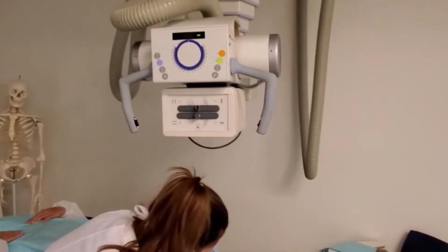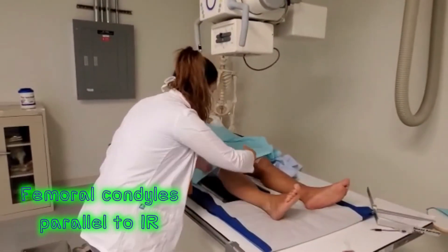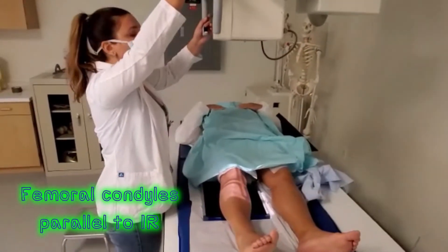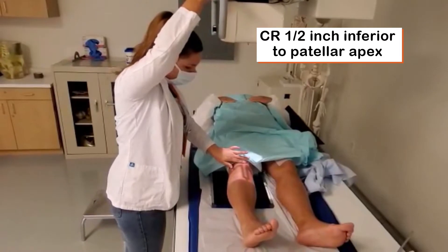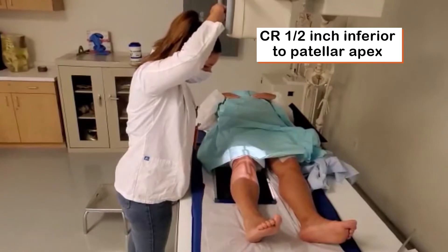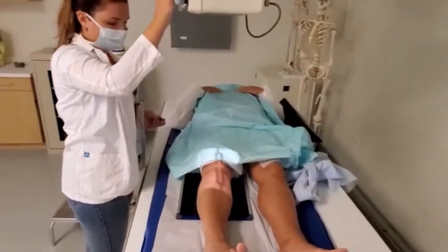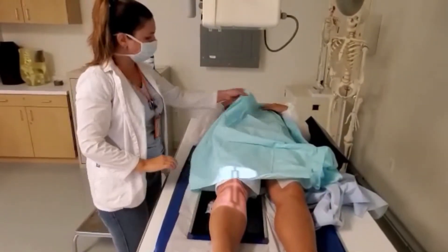We place the cassette under the knee. We make sure that the femoral condyles are parallel to the IR. Our central ray enters at a half-inch distance to the apex of the patella. Don't forget to collimate, use the marker, and never forget to do the shielding.